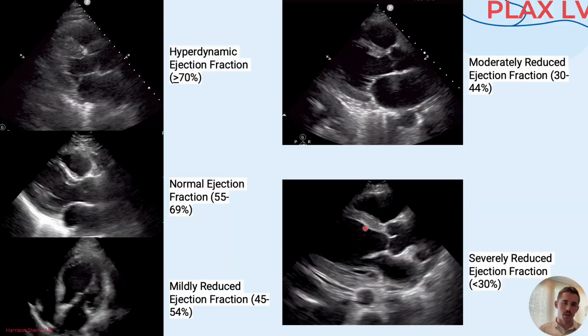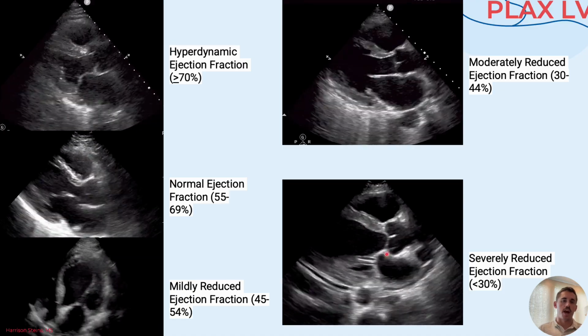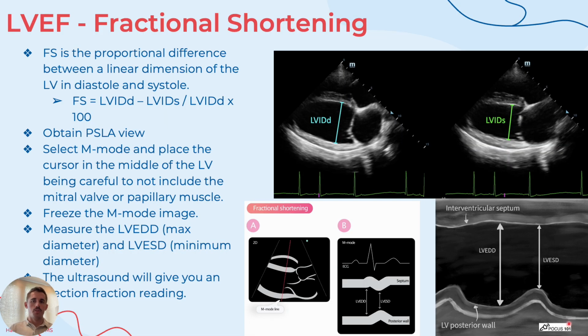So we can see here. Same with the right ventricle here. So this interventricular septum's pretty static, and there's no movement inwardly of that ventricular wall. So we've taken our eyeball measurement. We've seen if the heart is hyperdynamic, if it's moving very, very quickly. We've seen if there is reduced ejection fraction qualitatively.